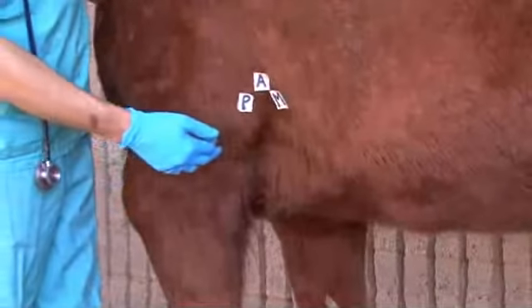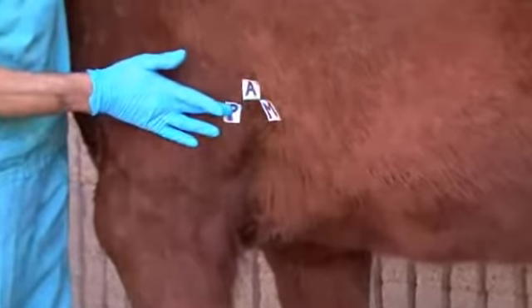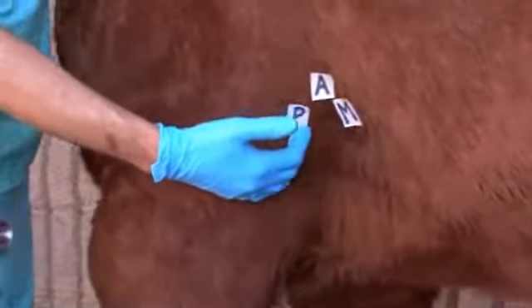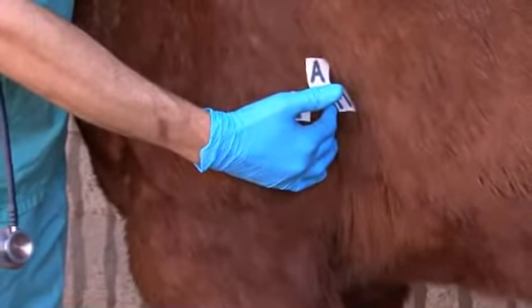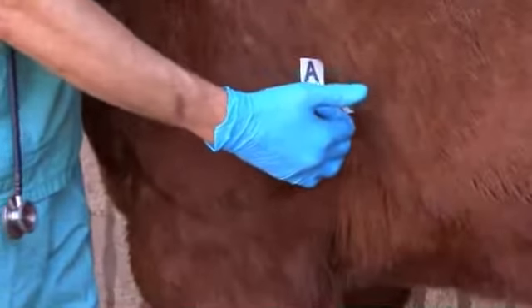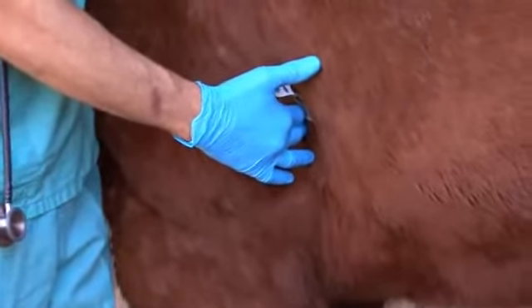It's important to note that the stethoscope head is placed under the triceps muscles, not directly on top of the triceps, because the musculature will muffle the heart sounds and make them difficult to hear. From a basic standpoint, the most important thing is to locate the loudest point of the heart so that you can get a reliable and consistent heart rate. As you begin to learn to auscult with more experience, you can focus in on the different valve points. But for beginners, it's most important just to find the loudest point of the heart rate.